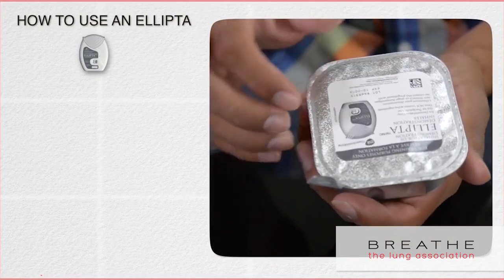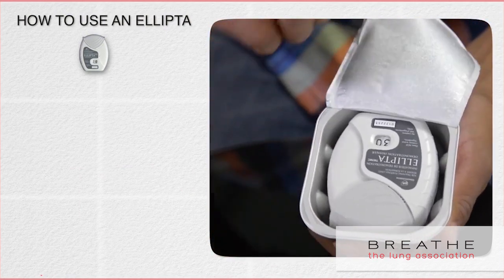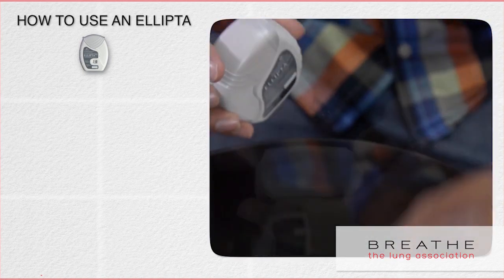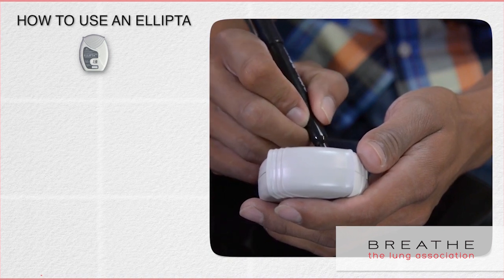On first use, you will have to open a foil tray and remove the inhaler. Discard the packaging and tray. On the inhaler, write the date the package was opened as well as the discard date for six weeks from opening.